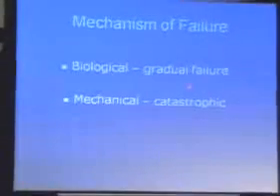This is a very important slide. It shows the mechanism of failure in a bioprosthetic valve. It is always gradual. It is in months or years. Unlike in a mechanical valve, if it gets blocked, the patient does not have time even to reach the hospital.